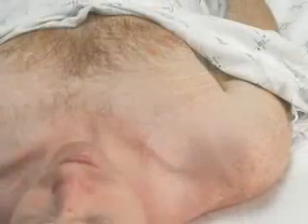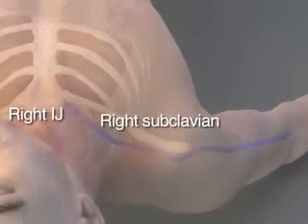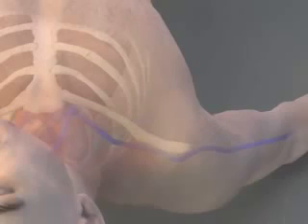Turn the patient's head so that the chin points away from the vein. Generally, the right internal jugular vein is preferred, since it provides a more direct approach to the superior vena cava. Remember, positioning is instrumental in the success of the procedure.